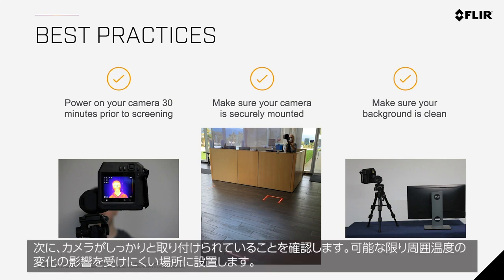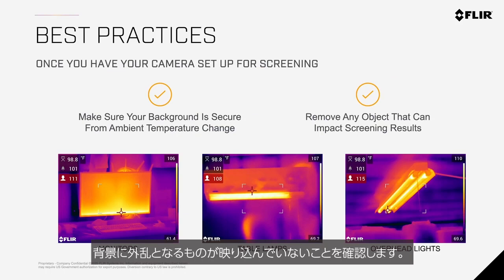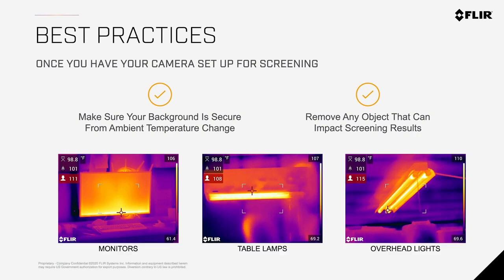Next, make sure your camera is mounted securely and, if possible, in a location where the ambient temperature is less susceptible to change. Make sure that your background is clean. Hot objects in the field of view, such as lamps, monitors, and computers, can impact your results.